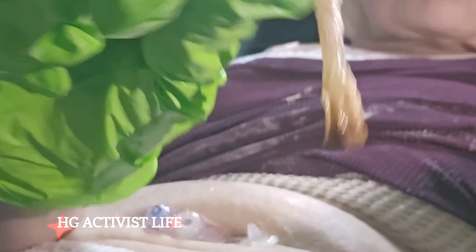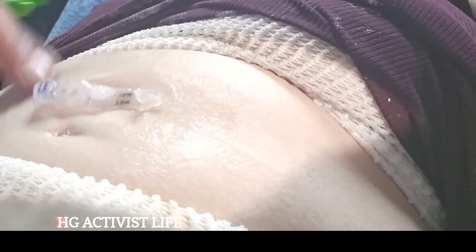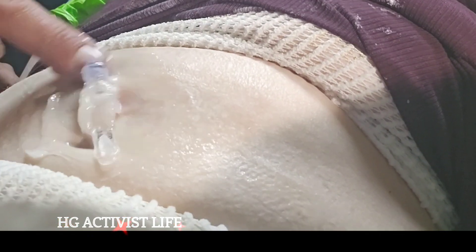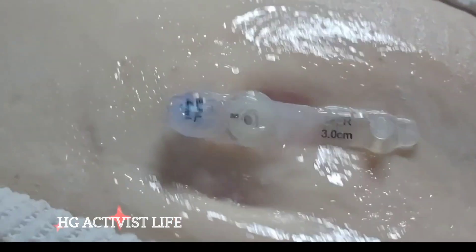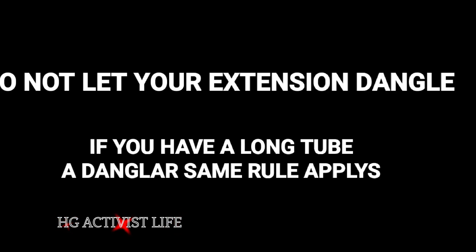It's nice to have a new one — this is the old one, so it gets all nasty from being on it; all the white stuff is cream. You want to cake cream on it. This is Neosporin, one for pain and scars — I like using this better than Vaseline.